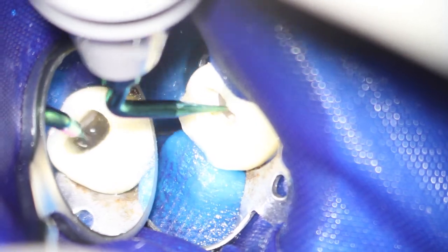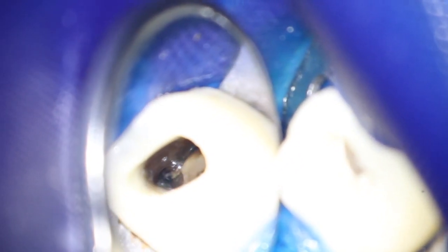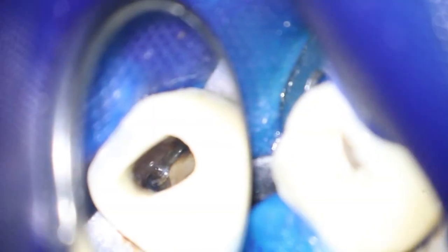So it's necessary to irrigate more than once, and now after some approaches in the same manner the canal is almost clean. But you also can see that there is a resorption of the root tips, and therefore you have to be extremely careful with the irrigation of sodium hypochlorite now to avoid any irrigation accidents that could lead to swelling and pain. That what you can see is periapical tissue that is necrotic as well.